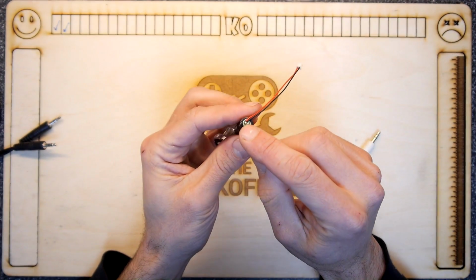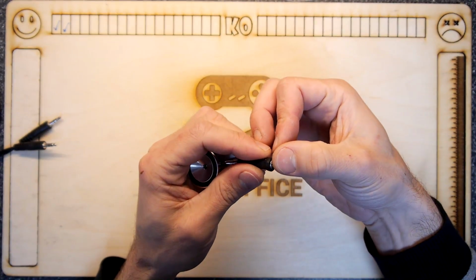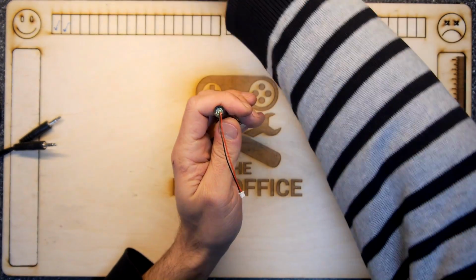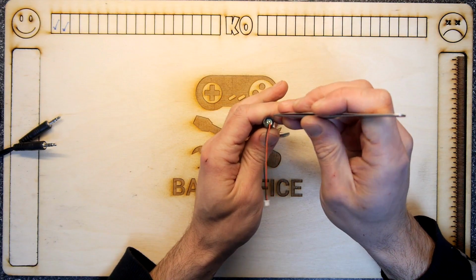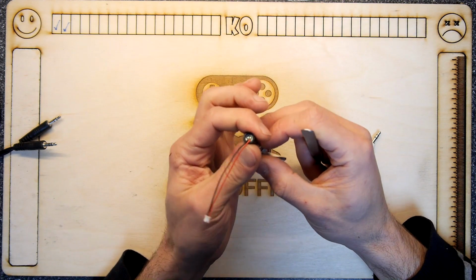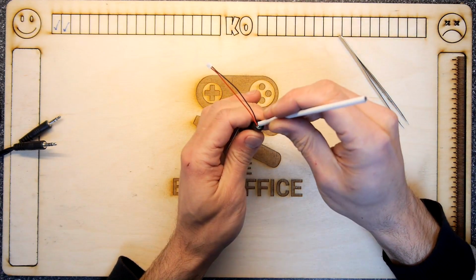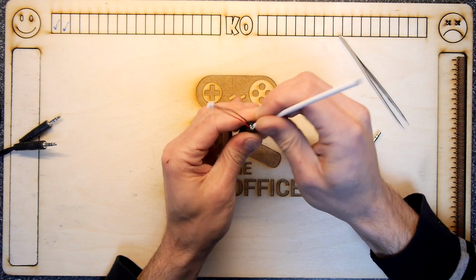So all I've done is just push the microphone in. It's that simple. You could see I just sort of did it because it's so quick, but yeah, just get the microphone and just pop it in. So the microphone will have to be a little bit smaller than the internal diameter of your silicone, so that's going to be something you might have to check when you go on eBay or something and buy the sort of microphone or whatever you've salvaged the microphone from. But I'm just seeing if I can actually push it down a little bit more. It'll just be quite nice and firm if I can, and it's not going to go anywhere.